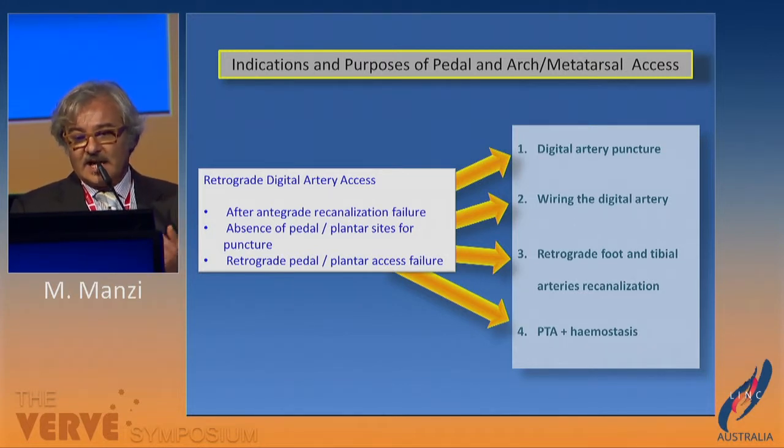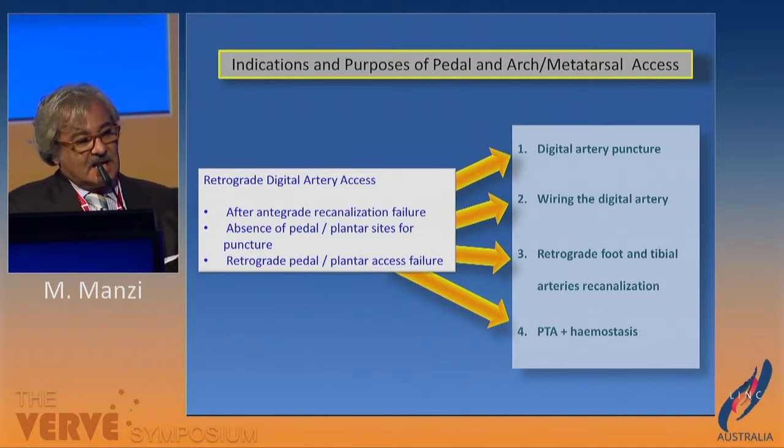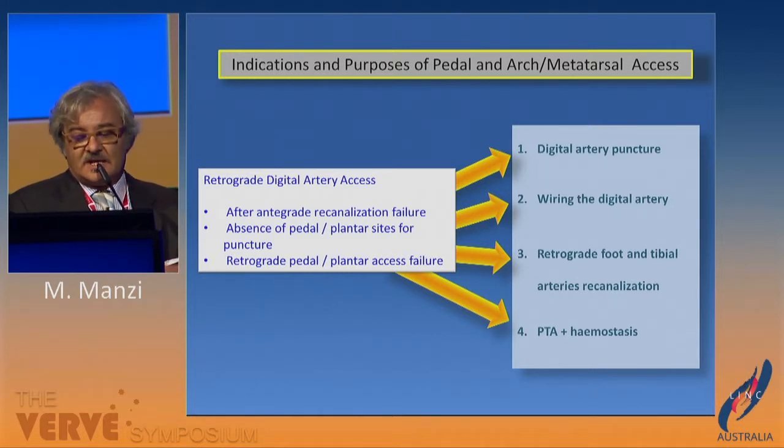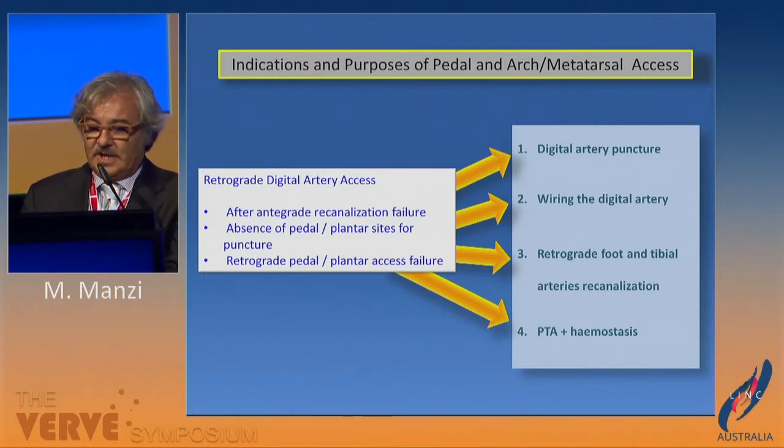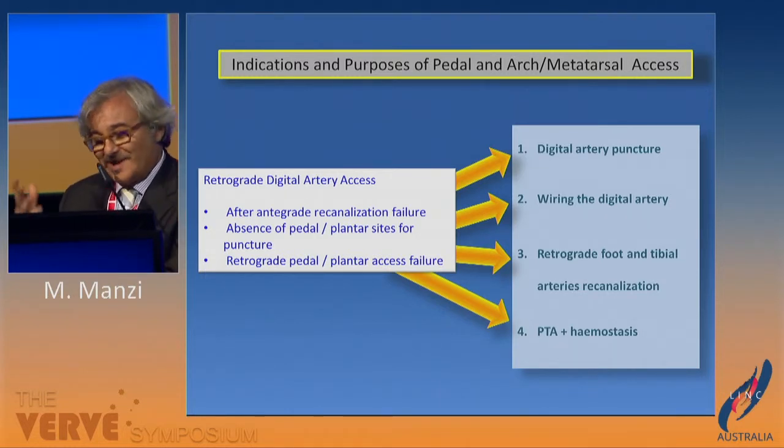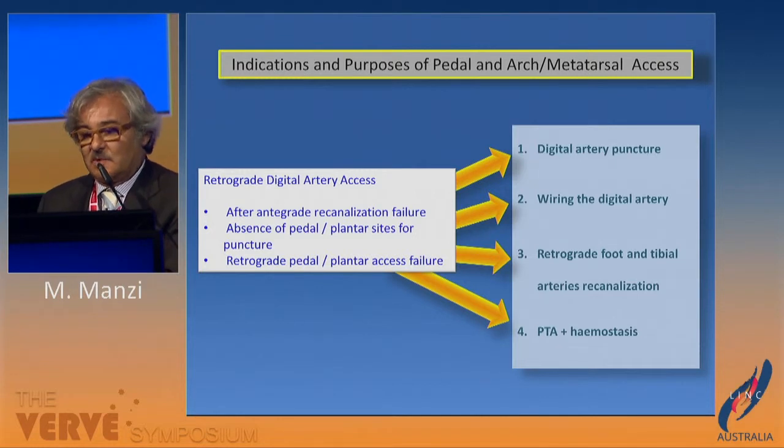So our indications were summarized by the case. After a failure of antegrade recanalization, or when we do not have any distal target vessel like a pedal artery or distal posterior tibial artery, it is possible to perform the puncture in the digital artery or metatarsal artery, more correctly. So the technique is schematic.